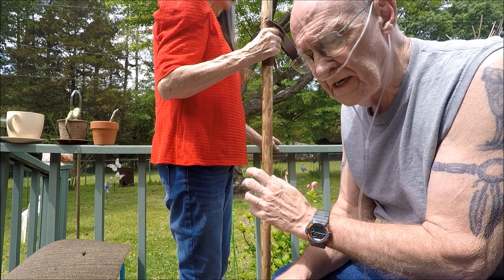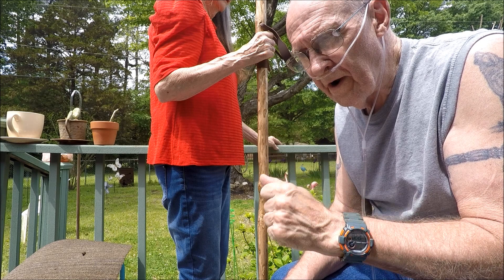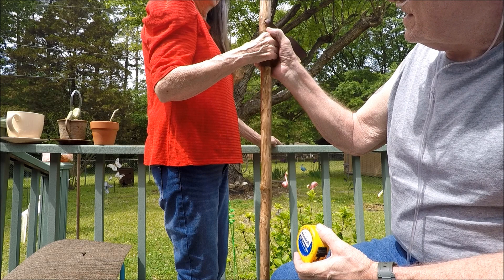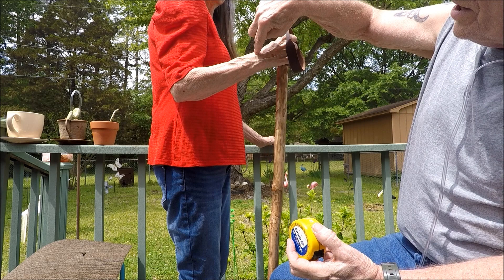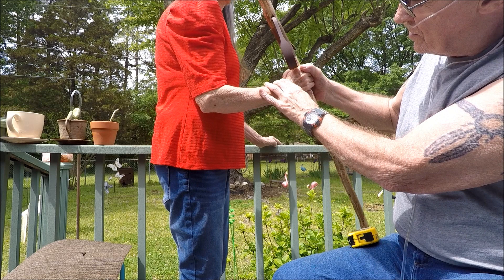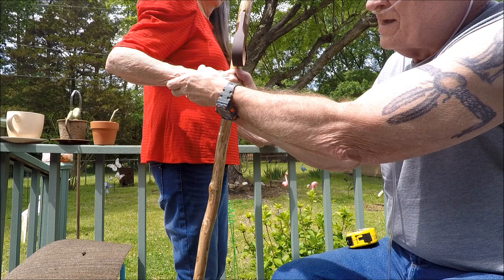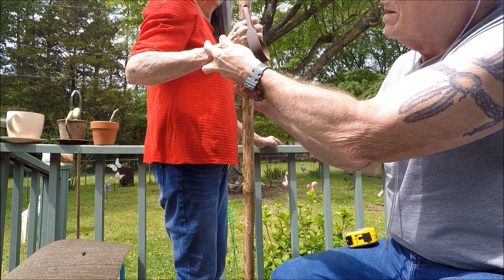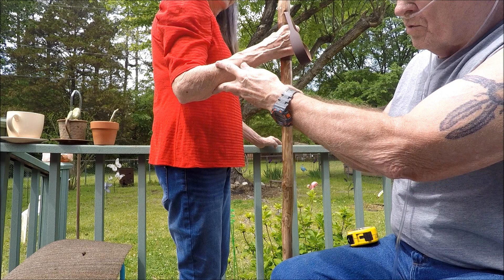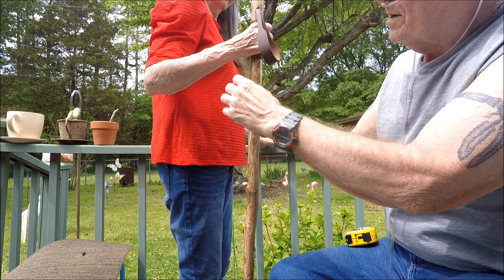For the walking stick, same thing — you want a slight bend in your elbow. A lot of guides will want you to hold it straight, but when you reach out with a straight arm, your wrist turns up, which is not comfortable. Same thing going backwards — your wrist turns up. When your arm is bent slightly and you go forward, your wrist stays straight. When you go backward, your wrist stays straight. That's what you want.